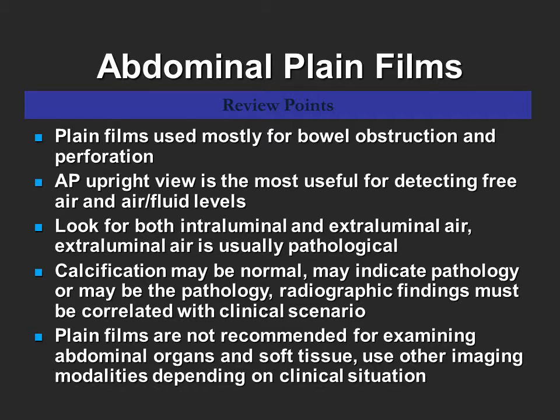In summary, plain films are used mostly for detecting bowel obstruction and perforation. The AP upright view is the most useful for detecting free air and air fluid levels. One should look for both intraluminal and extraluminal air on plain films, and extraluminal air is usually pathological. Calcification may be normal, may indicate pathology, or may be the pathology itself. Therefore, radiographic findings must be correlated with the clinical scenario. Plain films are not recommended for examining abdominal organs and soft tissues.